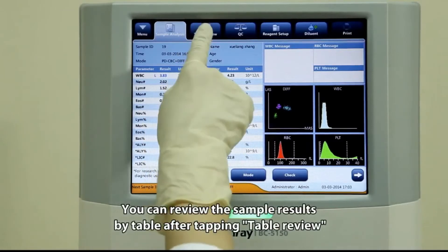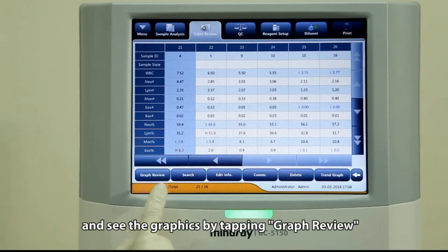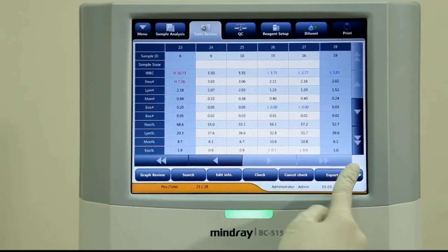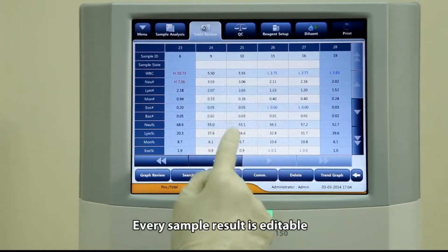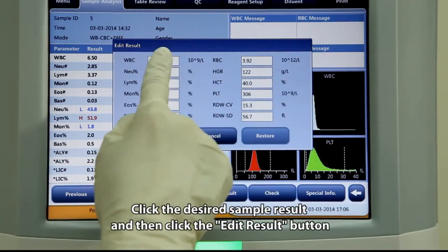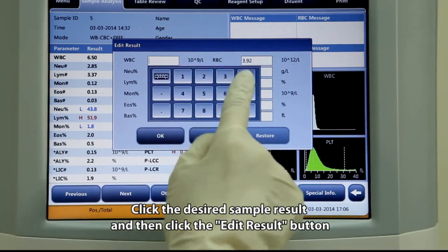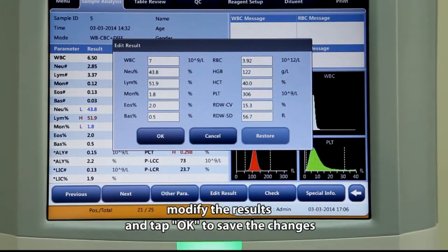You can review sample results in table form by tapping table review, or see the graphics by tapping graph review. For unwanted sample results, select and tap delete. Every sample result is editable — click the desired sample result, then click the edit result button, modify the results, and tap OK to save changes.